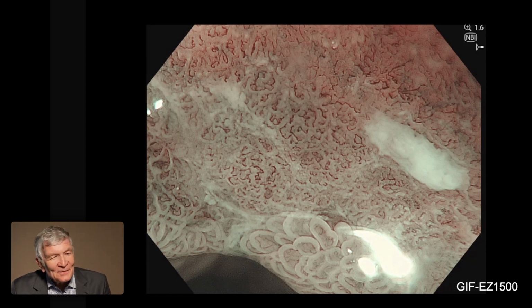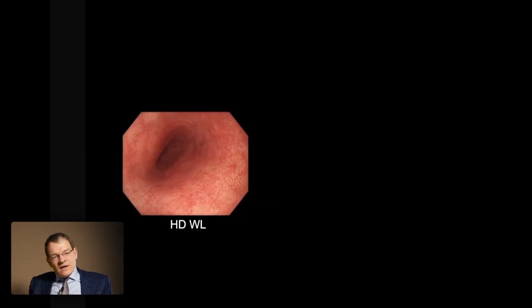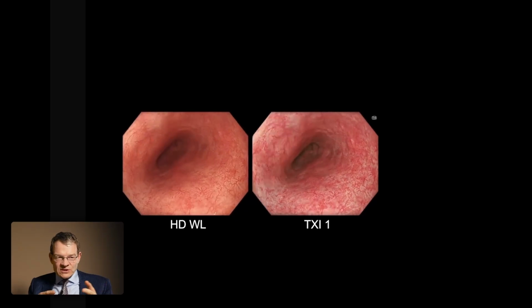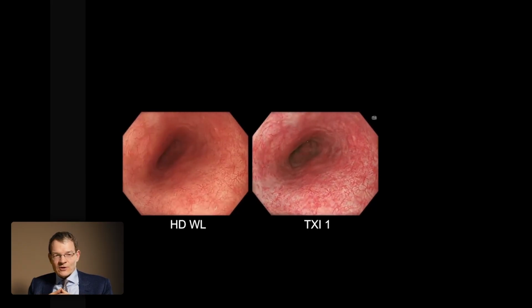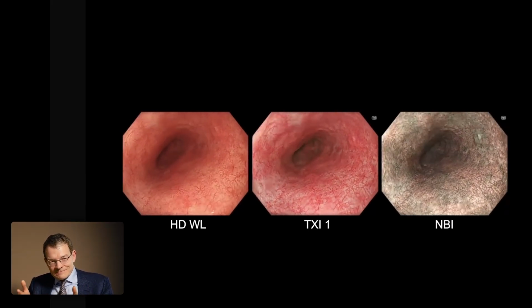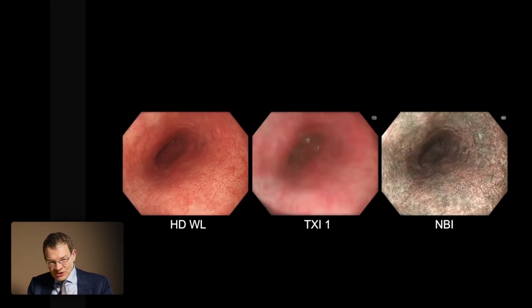Okay, let's go on. Okay, so this is another example. So that also should show you the new features. So this is the new white light. I think you will notice it is very sharp. You have a good illumination. And also in this patient, we have a lesion. I can tell you, it's at 2 o'clock. And the question is now, will these new features help us in the detection of such lesions?